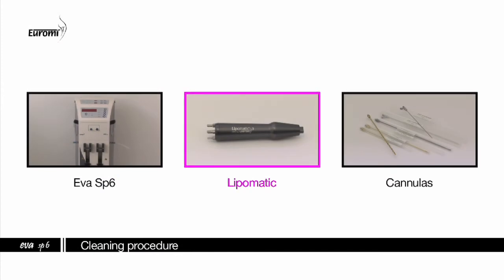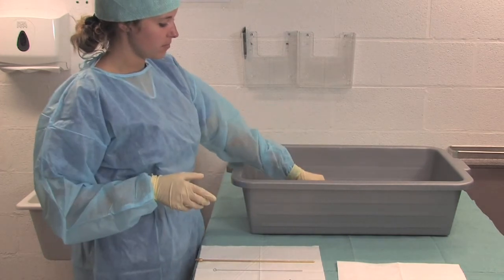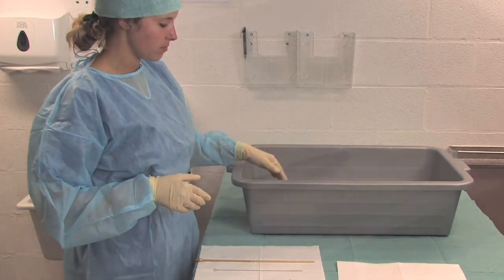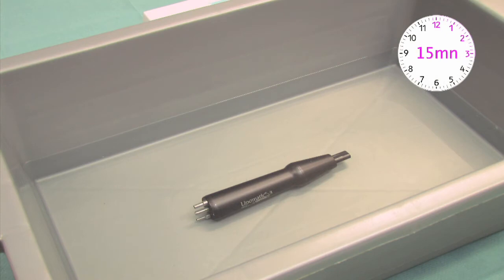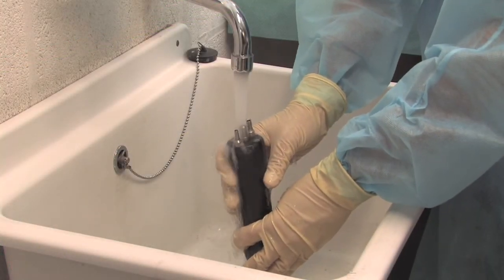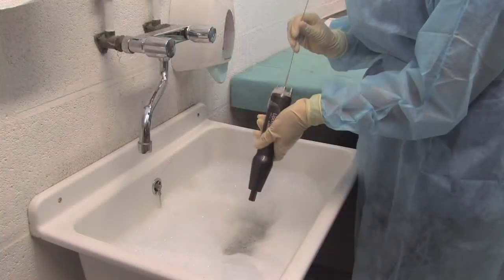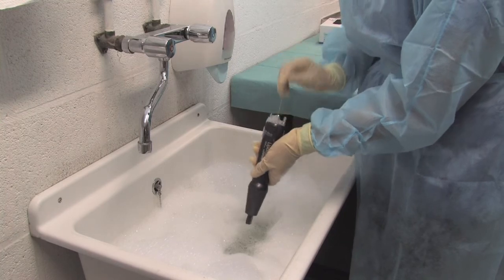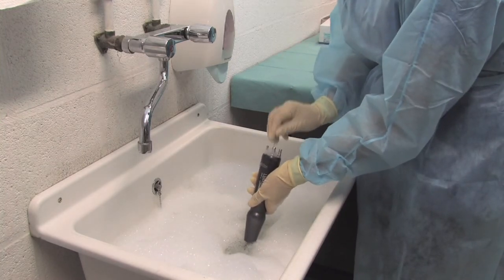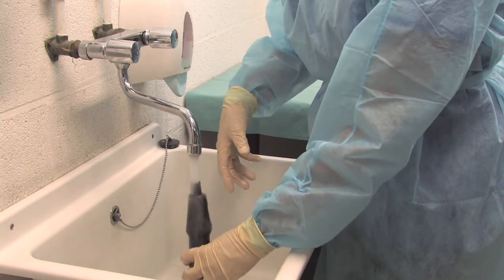Lipomatic cleaning. Soak the handpiece in disinfection liquid for at least 15 minutes. Rinse in clear water. Clean the Lipomatic in hot soapy water by using an appropriate brush. Rinse the central axis in clear water.